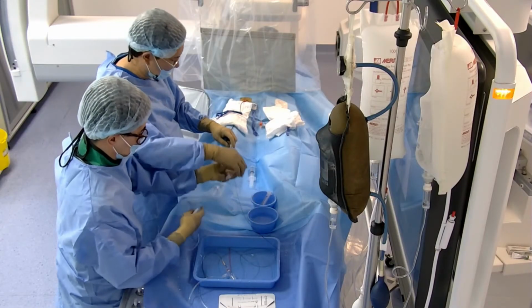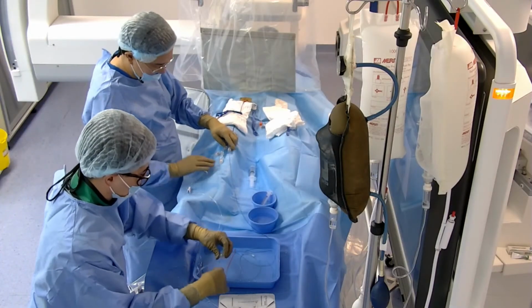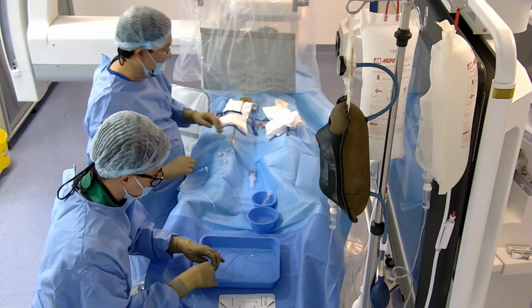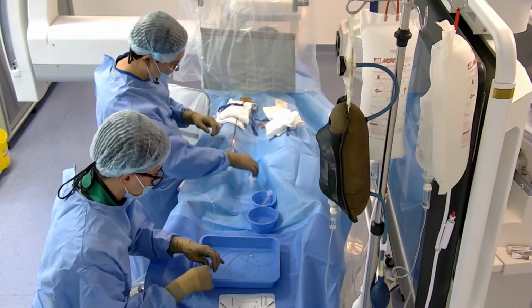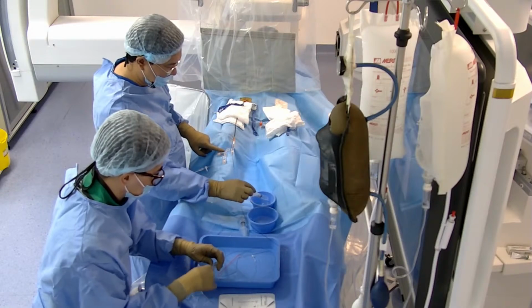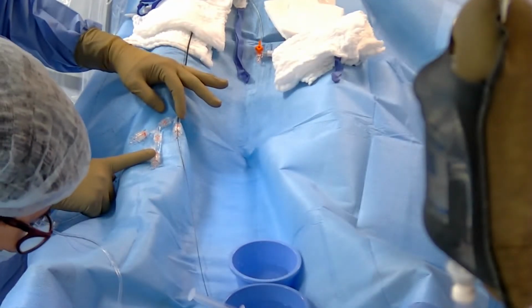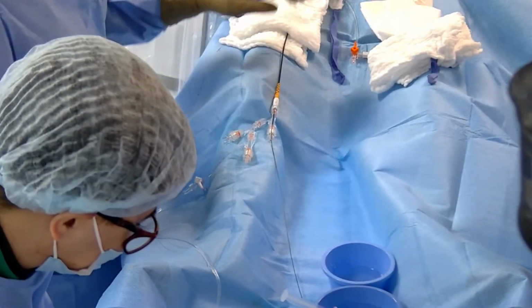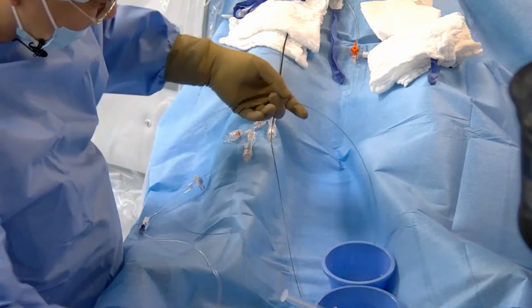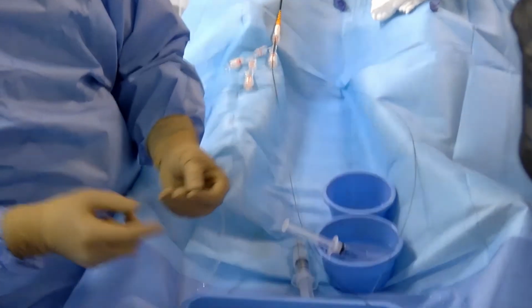Yes, we are not using heparin. That's why the flushing should be done all the time, and it's preventing mistakes and complications. I took 3 Y connectors, one for the Headway Duo and 2 for the Sonics. Okay. Headway Duo is ready.